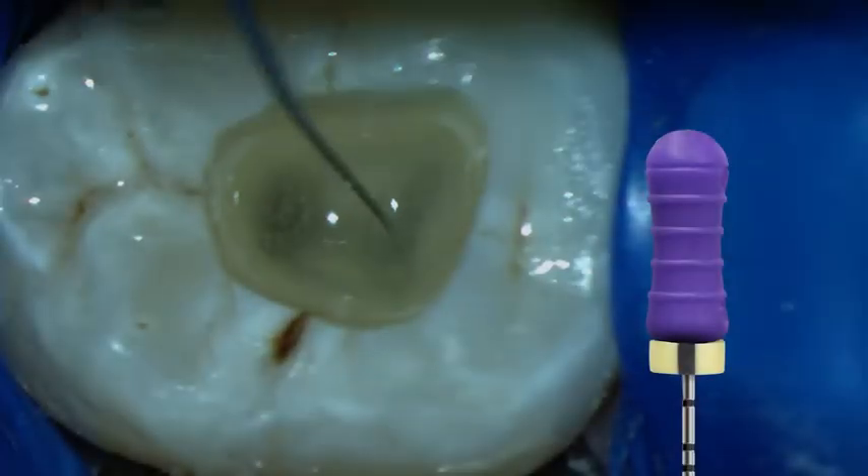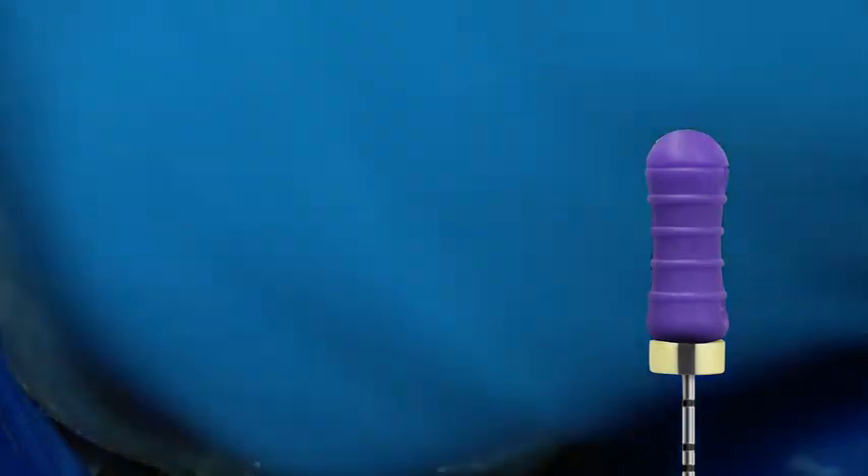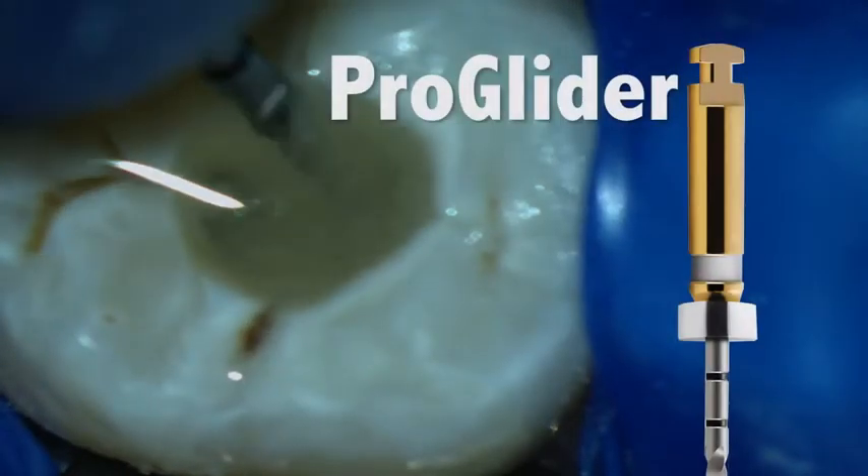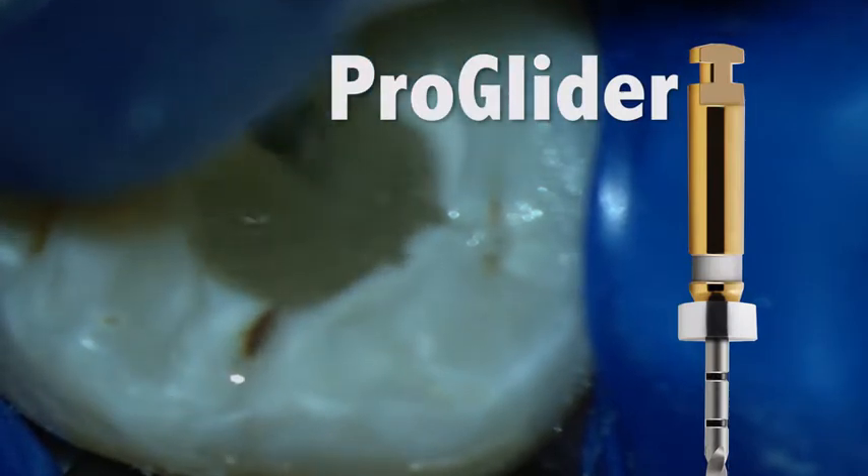This highly edited video already shows a case which has been negotiated with a number 10 hand file. The working length has also been established. A good glide path is necessary with the ProTaper Next sequence, just like any other system you've used in the past.